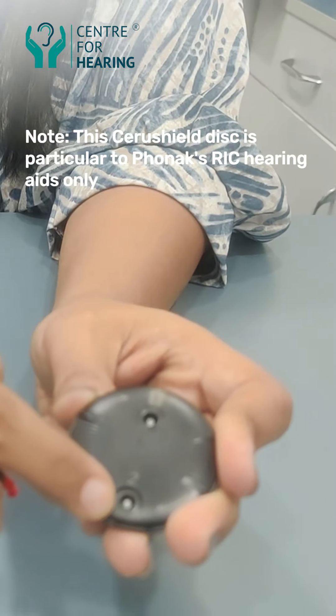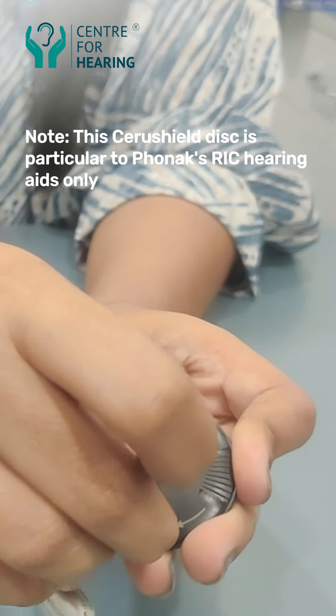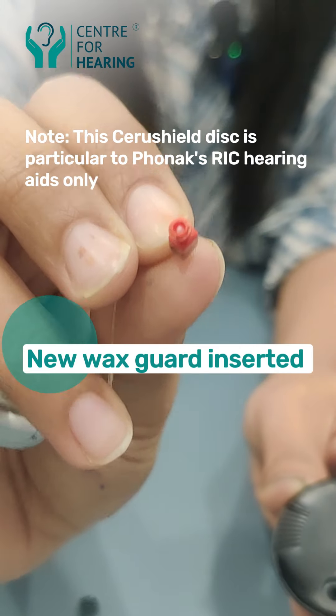Now you can put in a new wax guard. We will go to the second number. Hold it and press it, then release it. Your new wax guard has been changed.